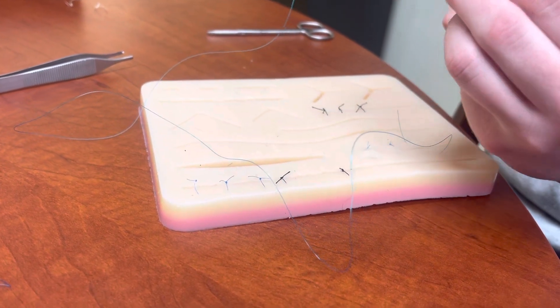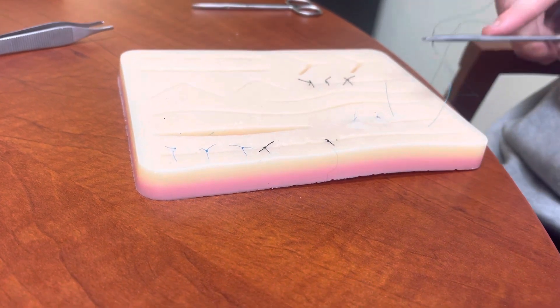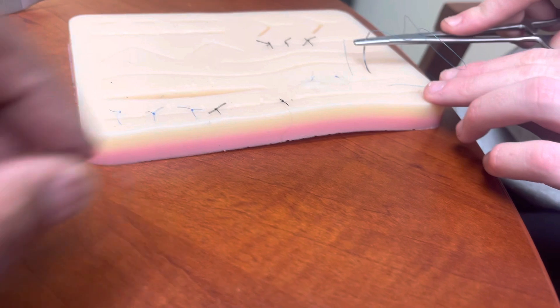There you got that. And now you're going to start, and you're going to go diagonally. Like this? Because you're trying to create that eight, so it needs to be more coming up to here now.